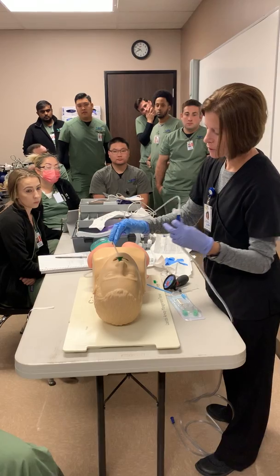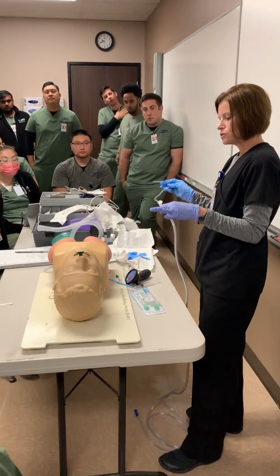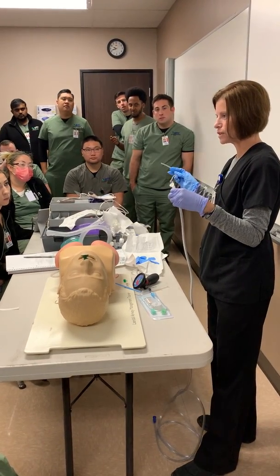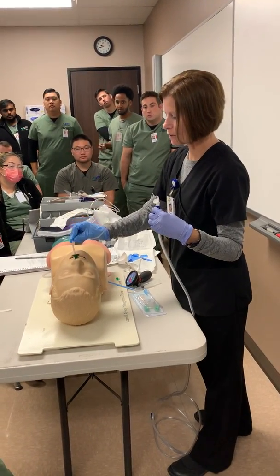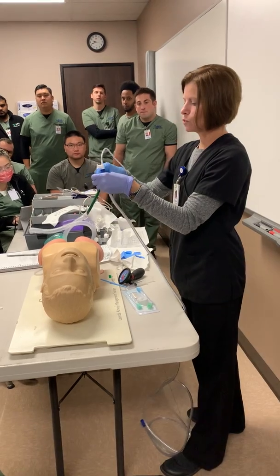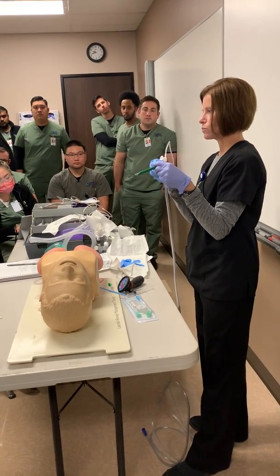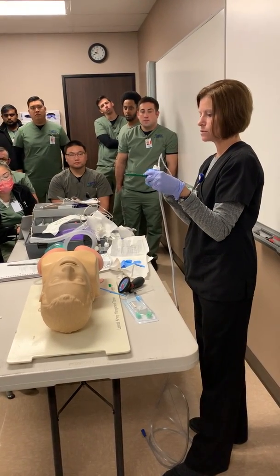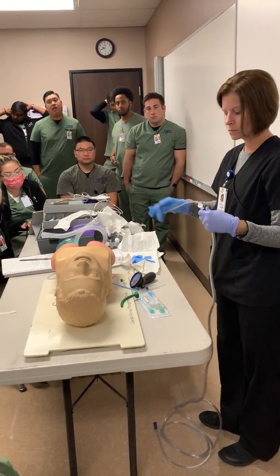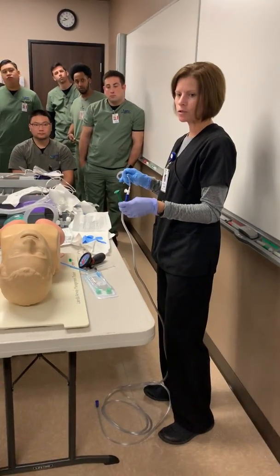This would go down. So if this is a 30, I think this is a 30 French. The cheater way is to just kind of divide it in half. So half a 30 is 15. I have a 14 French. That's still kind of a little bit bigger. A 12 would be better, but this will go down. But you can see it's kind of filling up that whole tube. So now if the patient needed to try to breathe around this as well, there isn't an opening for them. So that's why we would go down to a 12. Now, obviously, there's different sizes of the nasal trumpets. You'll see 28s, 30, and 32 most commonly. Okay.